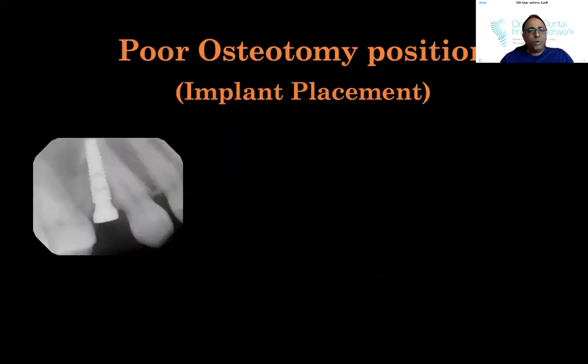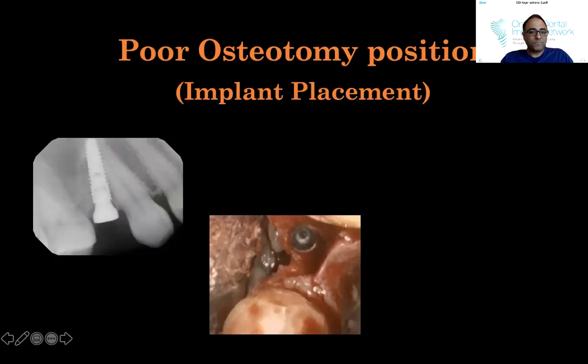So, poor osteotomy position. You'll notice, obviously, here the implant is literally hitting the canine, okay? This is a case, and again, this is an older case that I have, where the implant was placed, you know, not in the middle, because look at this huge void. So I'm trying to grab some decent bone.